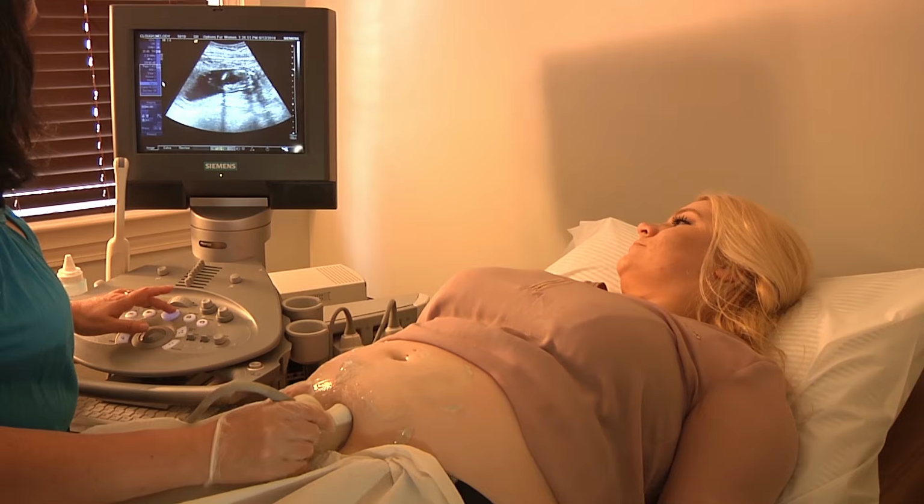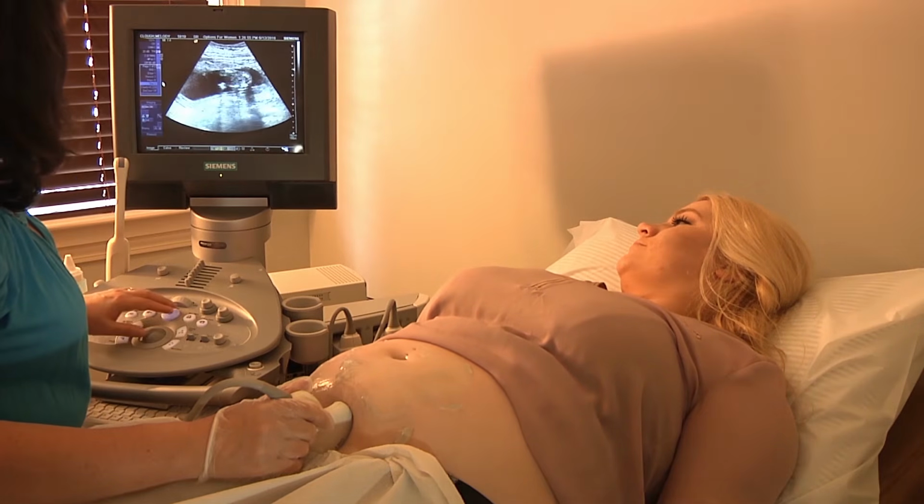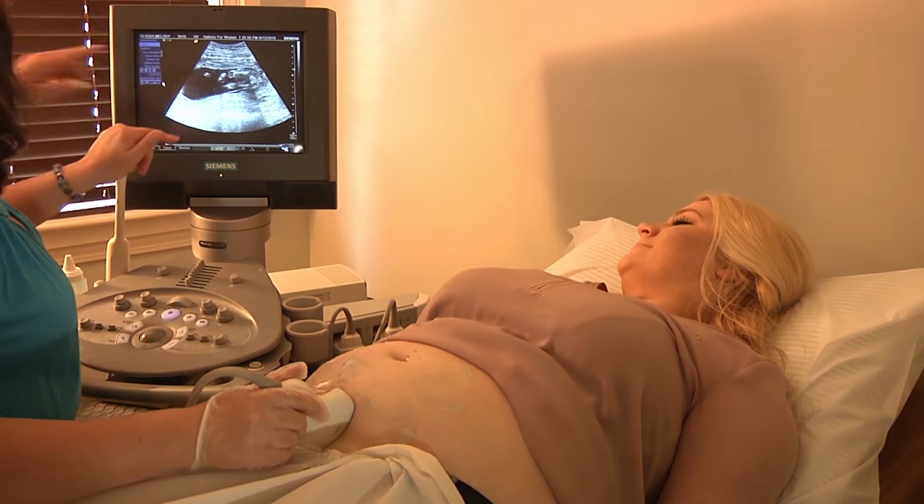Isn't that when you're so close? I know, I can see it. It's right there, but he keeps moving his leg. There, freeze. Yes, that's perfect.